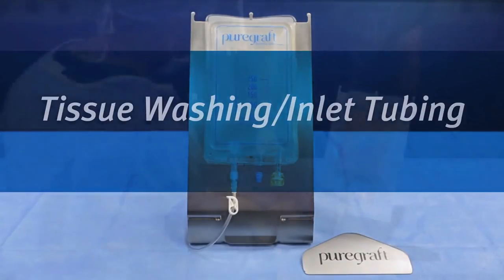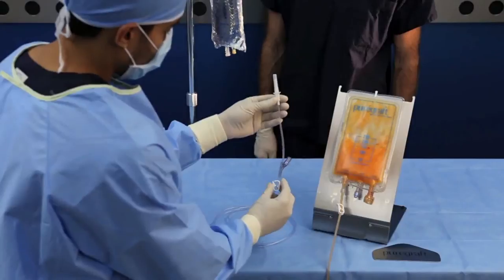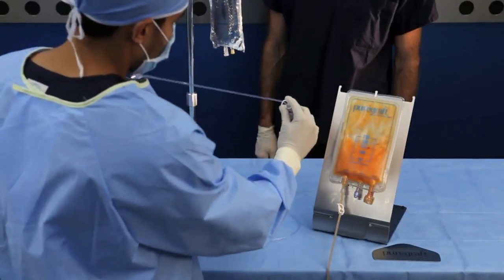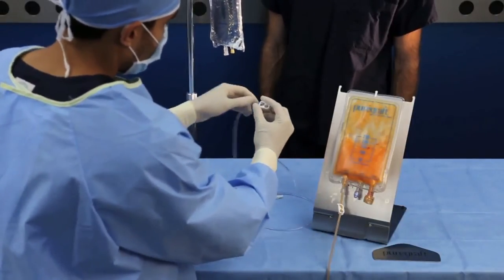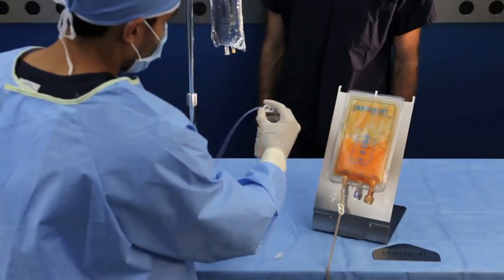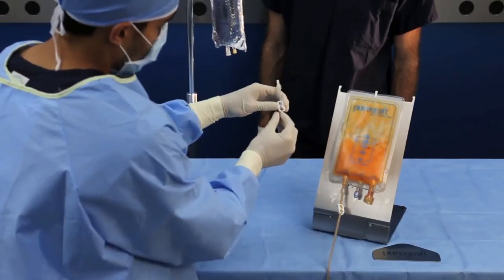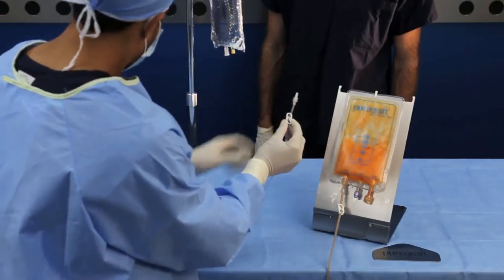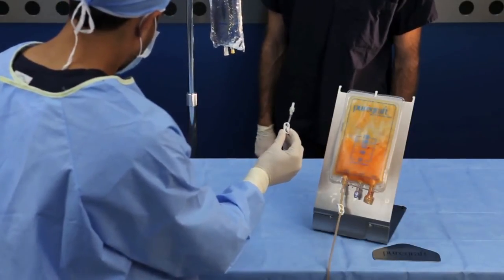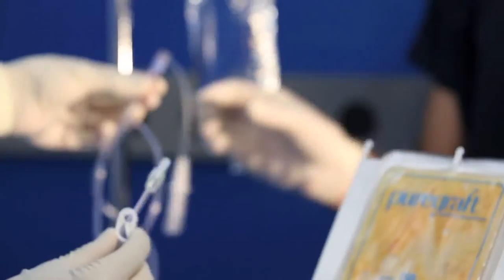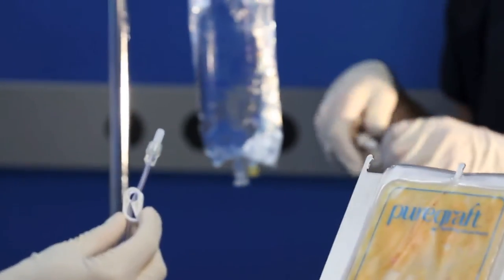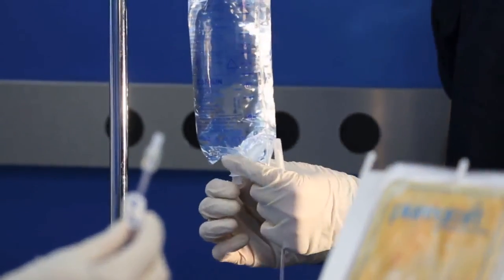For the second wash, the alternate lactated Ringer's addition method using the inlet tubing set is shown. For this method, close the clamp on the inlet tubing set and spike the lactated Ringer's bag.